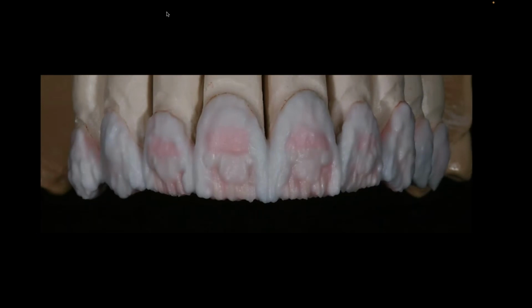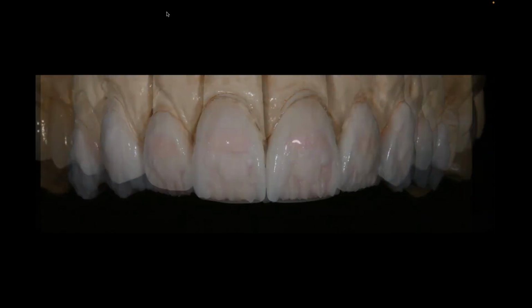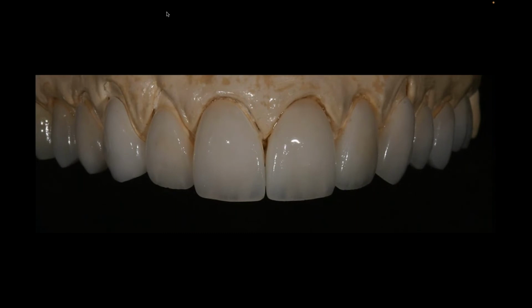I have chroma in the cervical third. I have value in that middle third area, and then I have my mamelons in effect around the incisal third. My shell, or my veneer, as you might want to consider it, or filtration system, as we've done in other webinars before, is going to be fairly transparent. So that means when those two kind of come together, this is the effect that I'm looking to create. Chroma, value, age. Those are the three things that I get by figuring out which enamel I wanted to use. So the brightness that you're seeing in that middle third isn't necessarily from the enamel, it's from what's behind it.